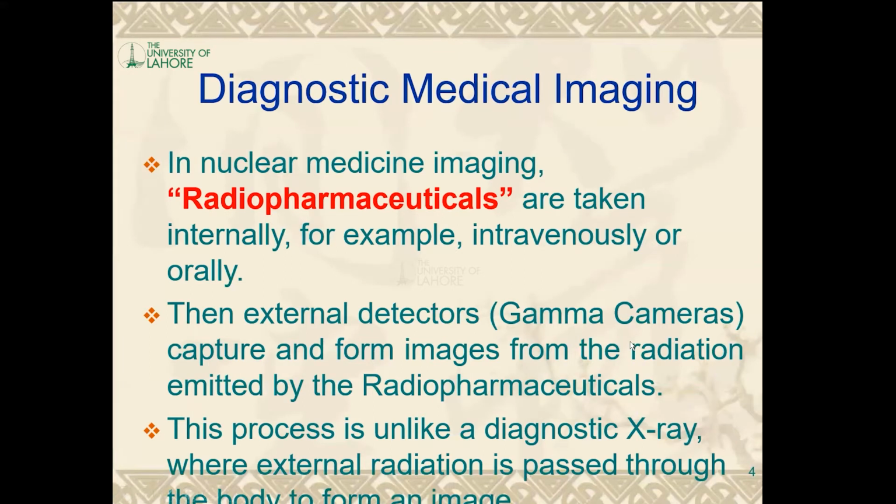This process is unlike a diagnostic X-ray where external radiation is passed through the body to form an image. So that's the main difference of the nuclear medicine technique, where radiation comes from within the body as compared to the conventional X-ray where radiation is provided from an external source.